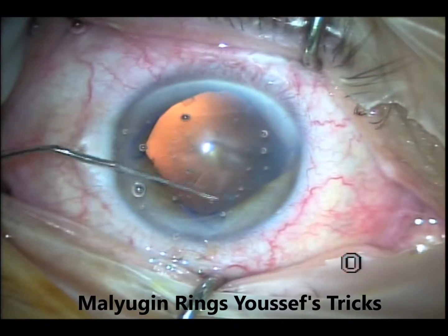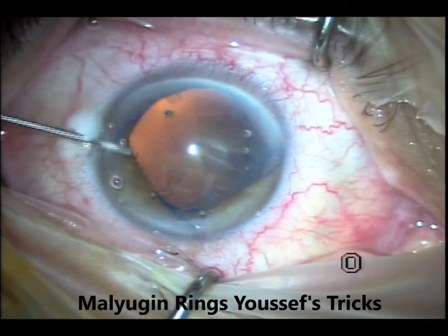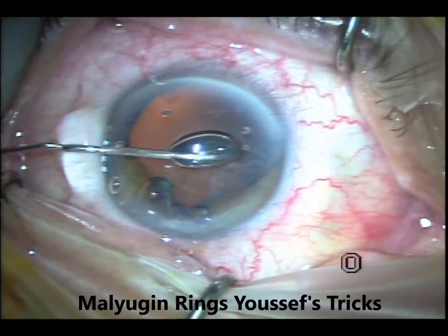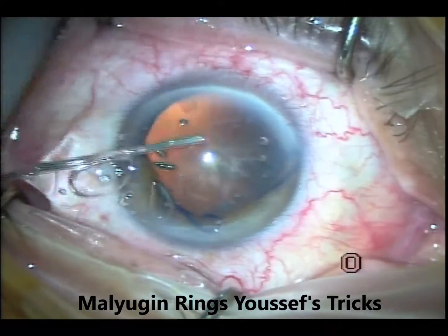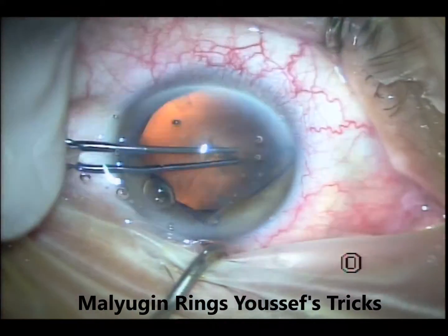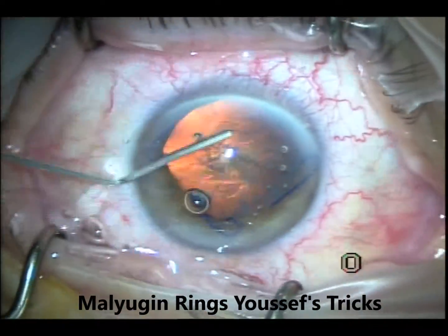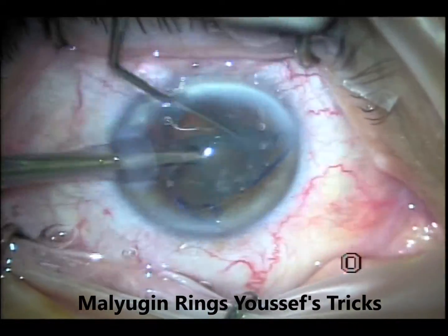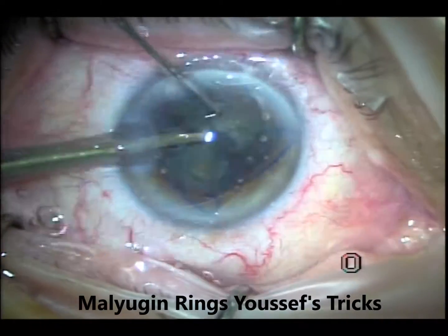I'll leave the nasal one to the end if it's not done at the beginning. Refill the chamber and fill it completely with viscoelastic. Remember, you have to put it peripherally, not just centrally — you have to compress the iris and the ring against the lens, because otherwise, especially if it's a floppy iris, you'll find that the ring and the iris are jumping all through the surgery. So put viscoelastic on top of the iris and the ring, preferably to push it against the lens.